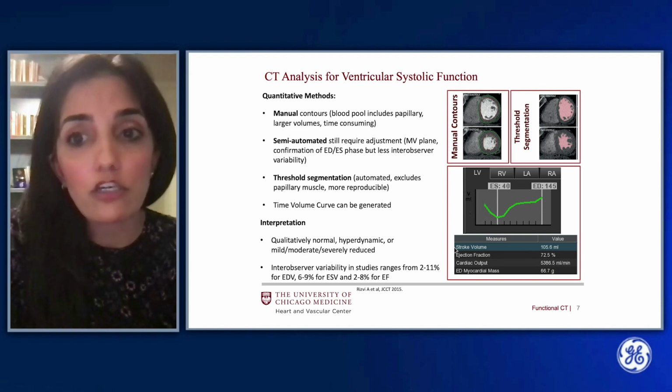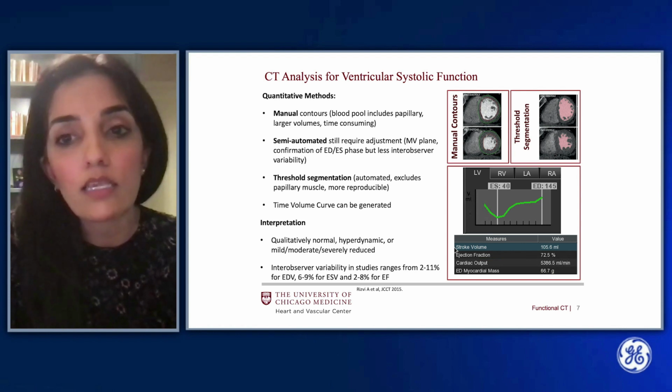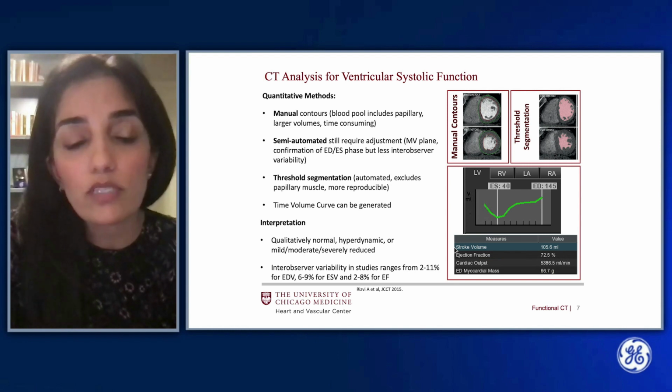Interpretation of systolic function incorporates the typical qualitative categories that we're familiar with from other modalities, with CT demonstrating reasonable inter-observer variability overall, reported in studies up to 11% for volumes and 2 to 8% for ejection fraction.